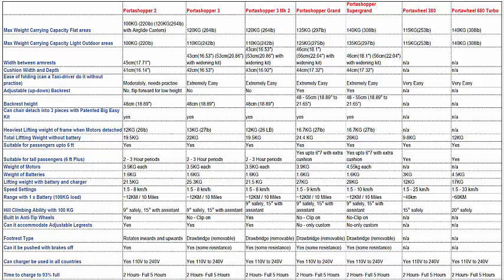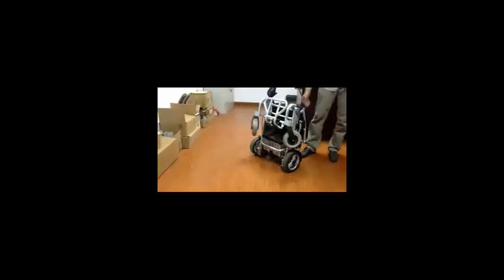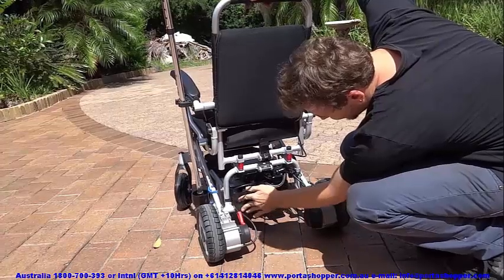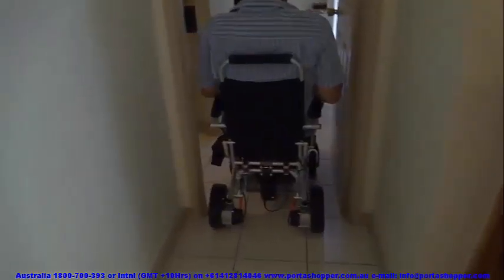Now we move on to the PortaShopper 3, our next generation wheelchair, which offers valuable new features primarily in ease of folding and unfolding. It literally folds up as easy as a lawn chair and anybody will be able to work out how to do it instantly — no other model even comes close. This makes it ideal for someone who relies on taxi drivers and caregivers. It can also take up to 3 batteries in parallel, providing a range of between 35 and 45km per charge.